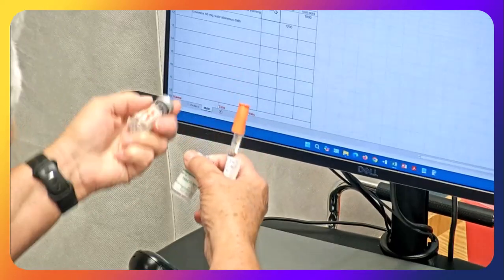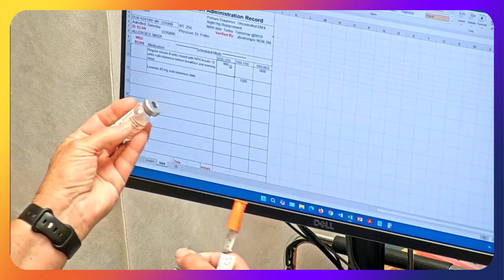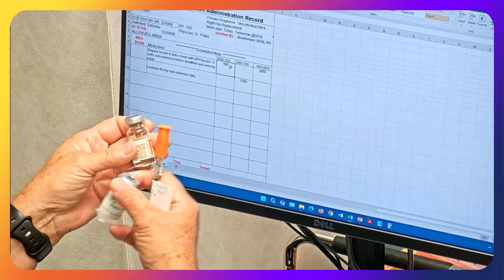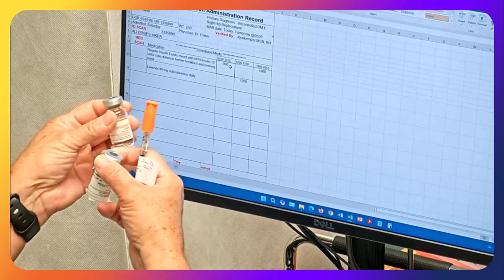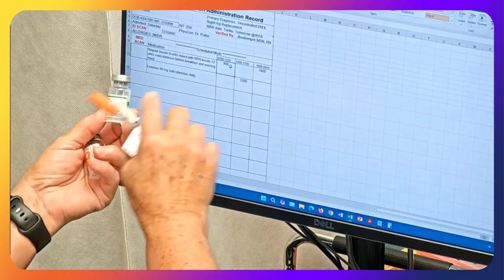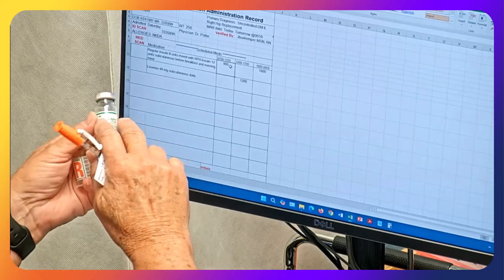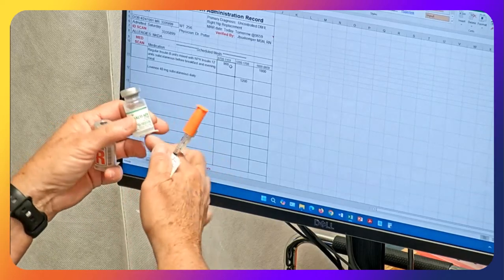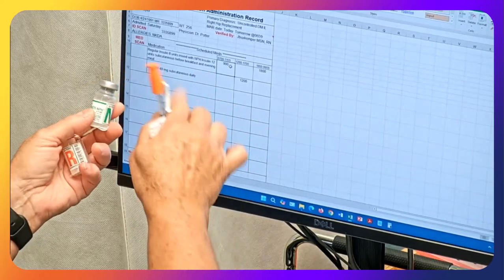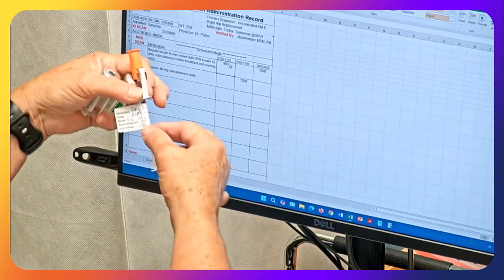And so in my hand I have regular insulin at U100. Okay, expiration was 3/22/26. I've dated, timed, and initialed it so they know when it's good within the 30 days, okay? That matches. And then I have my NPH insulin U100, 20/26. Again, it's dated and timed for the 30 days. And we're going to be giving 12 units. We're going to be giving these sub-Q before breakfast and evening meal at 9 o'clock.